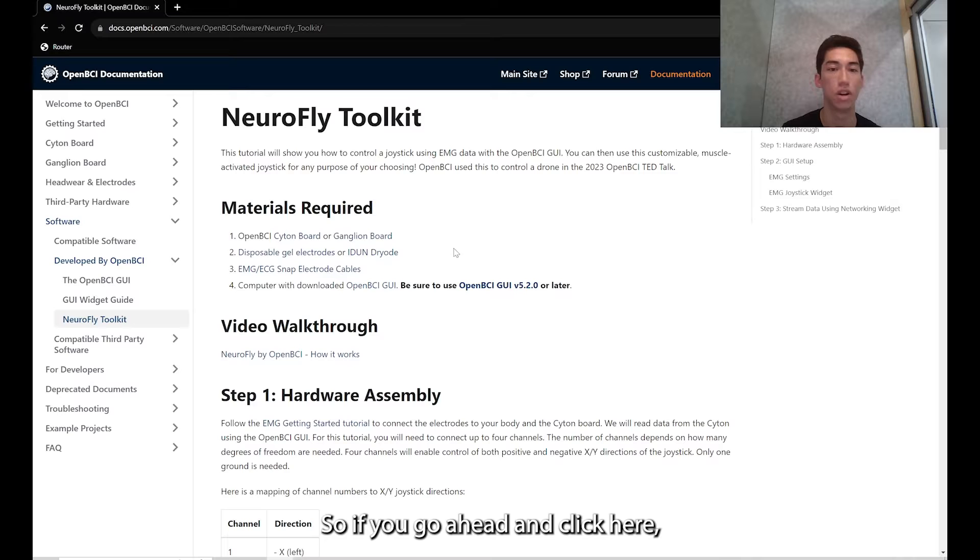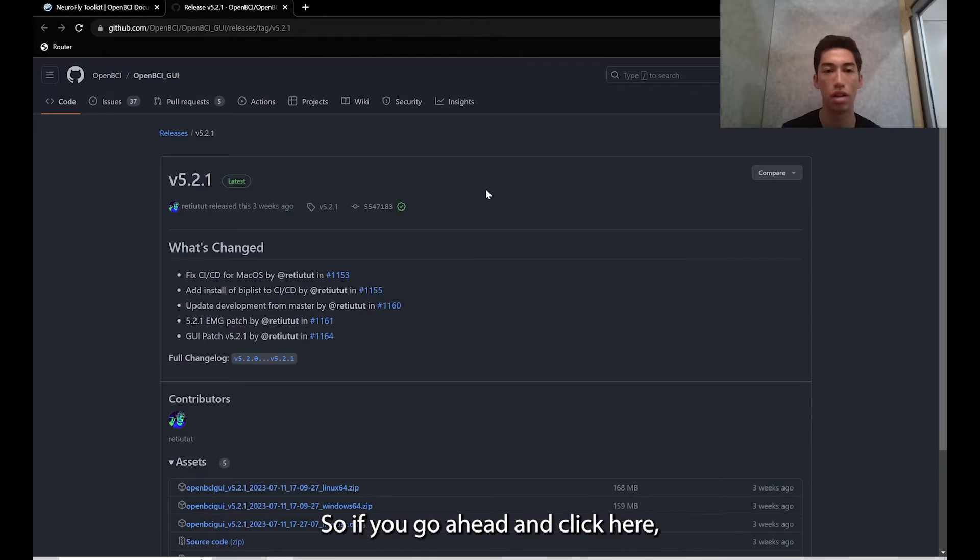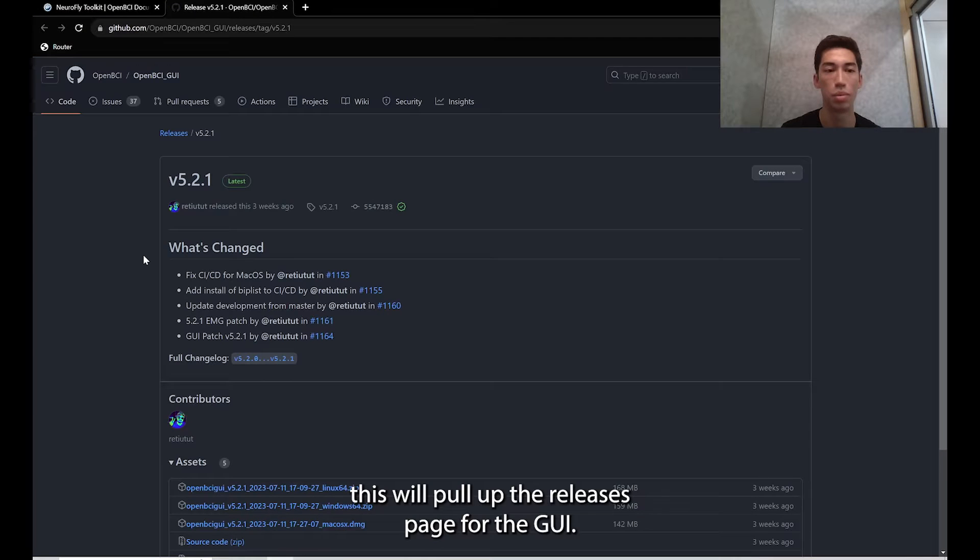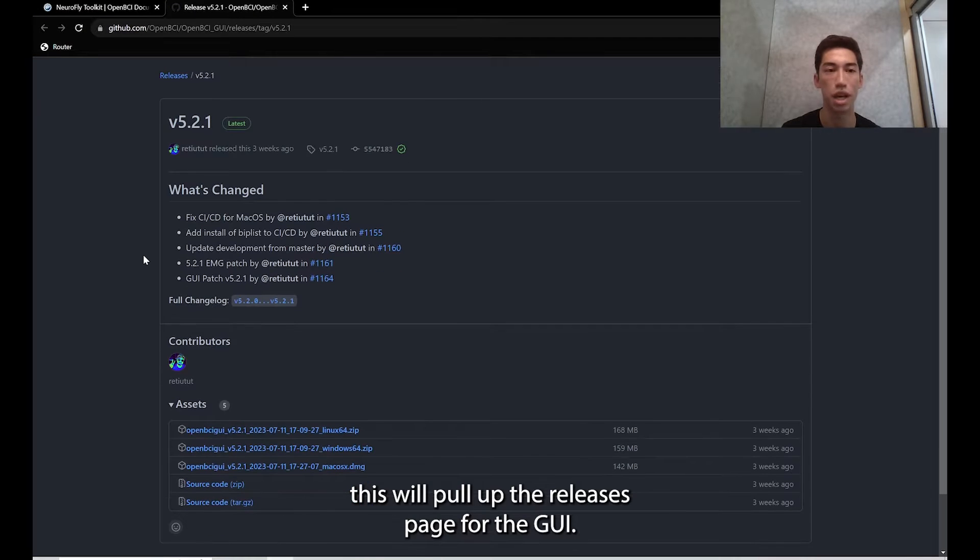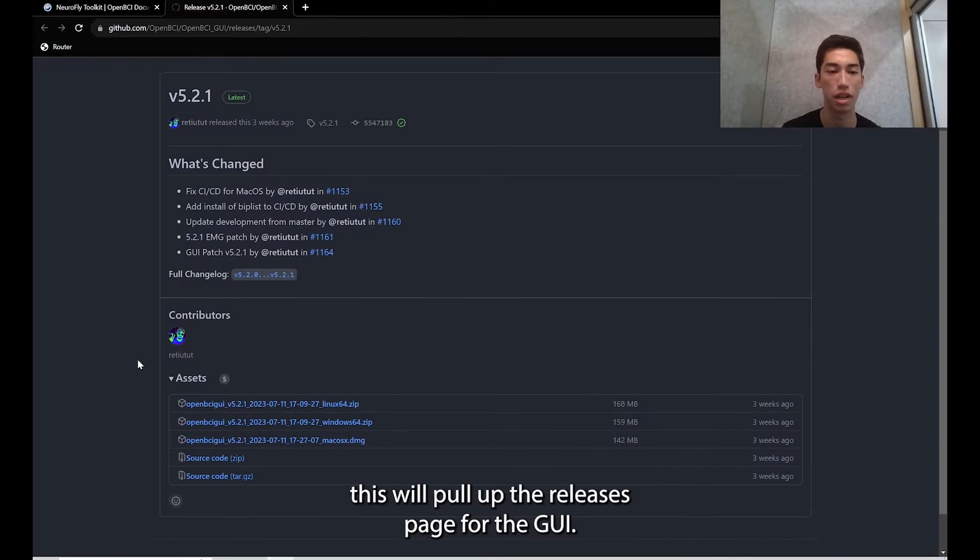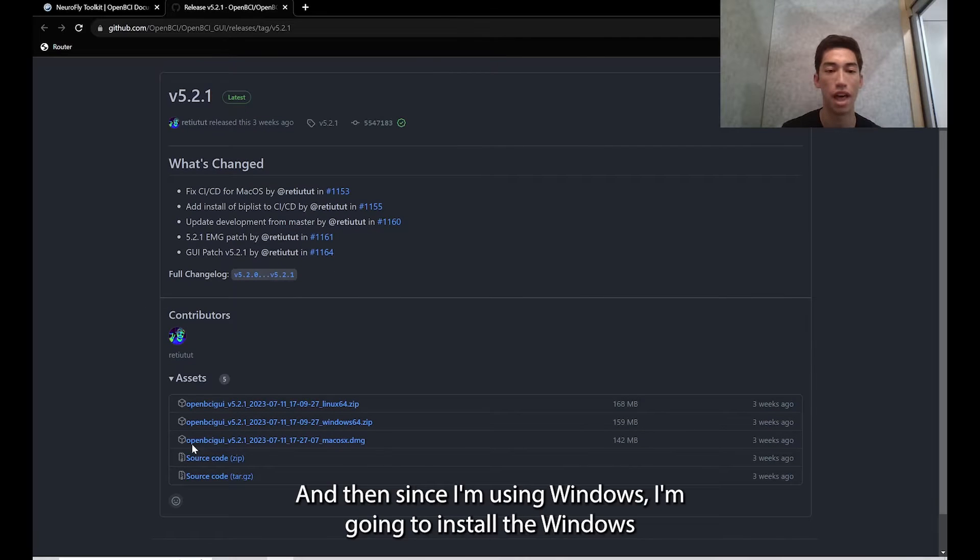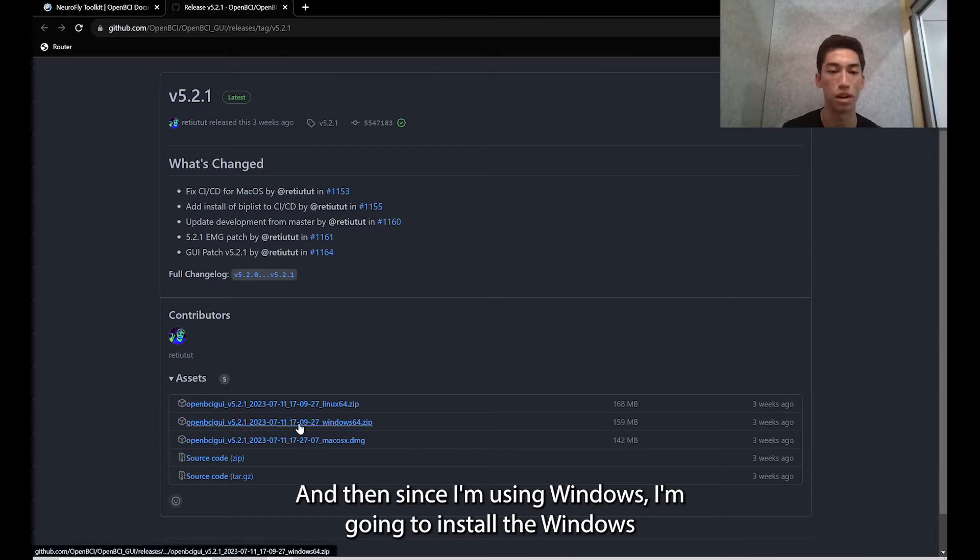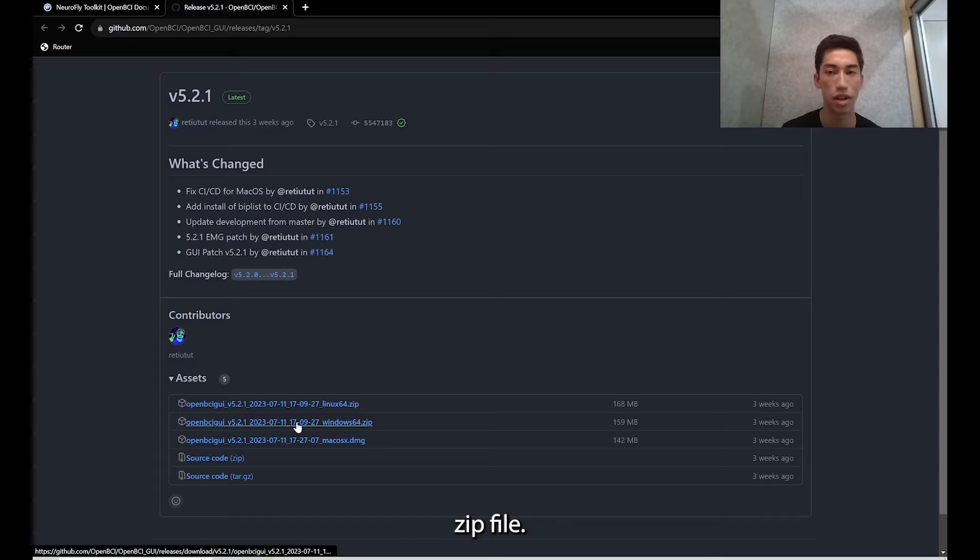If you go ahead and click here, this will pull up the releases page for the GUI and then since I'm using Windows, I'm going to install the Windows zip file.